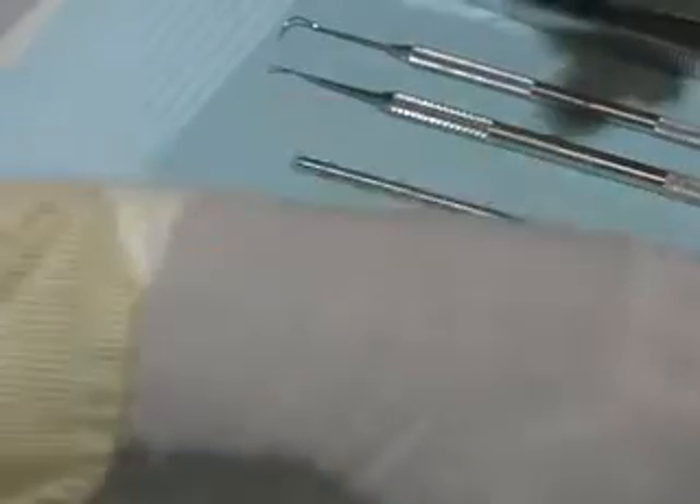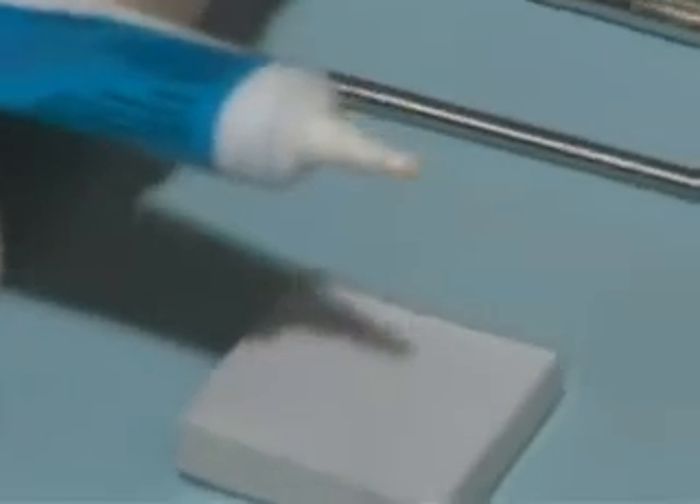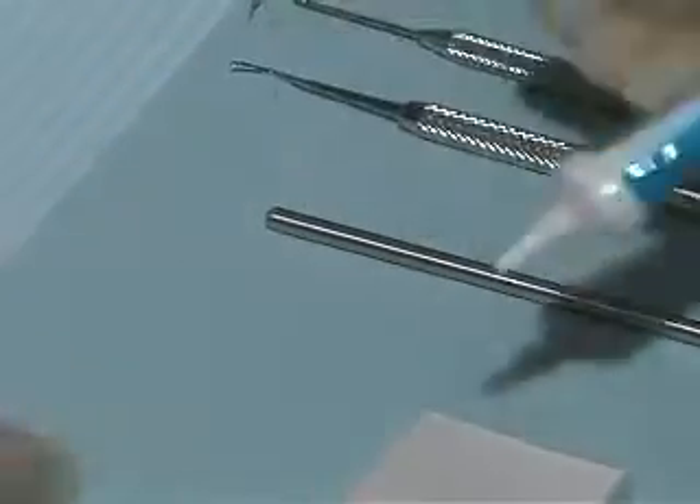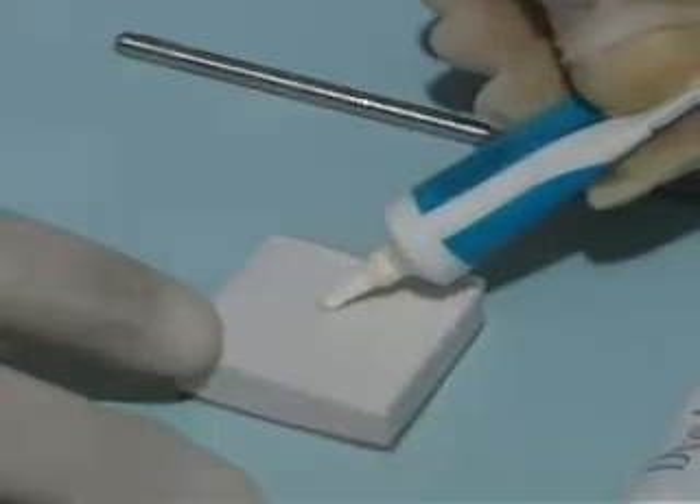Dispense the base first. Squeeze from the bottom of the tube to extrude a tiny amount. Wipe the nozzle clean and dispense approximately one millimeter of Dical onto the mixing pad.